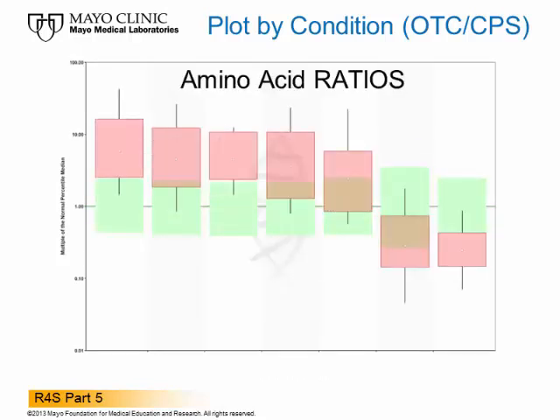The diagnostic utility of low citrulline could be much improved by giving proper consideration to at least 7 different ratios. 2 of them, methionine to citrulline and citrulline to phenylalanine, are commonly used as markers of conditions with abnormal levels of methionine and phenylalanine. Citrulline is often used to calculate ratios because this amino acid is the least influenced by total parenteral nutrition and other types of interference.